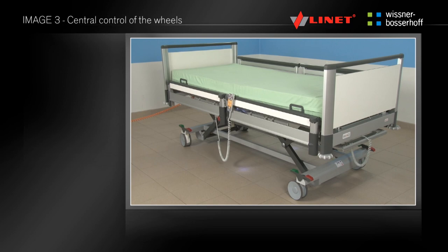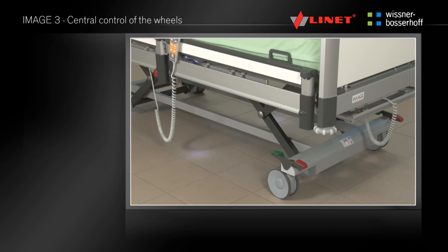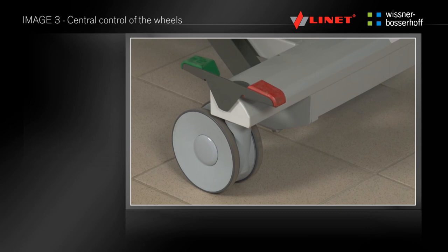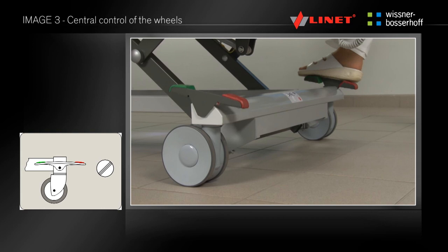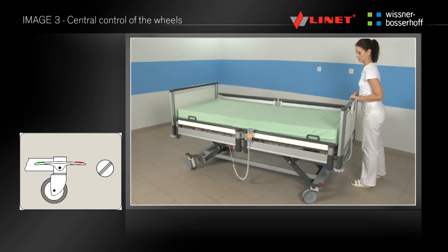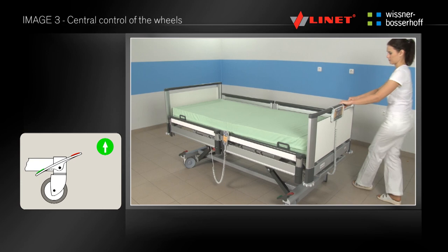The double reversible lever for central control of the wheels can be found close to the foot or head end of the bed on both sides of the chassis. All wheels can be controlled from one place. If the red pedal is in the down position, all wheels are stopped. If the lever is in the horizontal position, all wheels are released. If the lever is located with the red end upwards, the locking of wheels is activated in a straight direction, intended to facilitate transport of the bed.